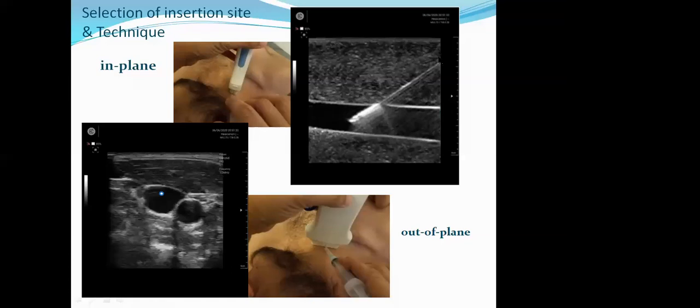When I insert the needle and puncture the tissue, you can see the entire length of the needle. In the in-plane technique, you can see the needle in its entire course, and you can see the tip of the needle right in the center of the vein.